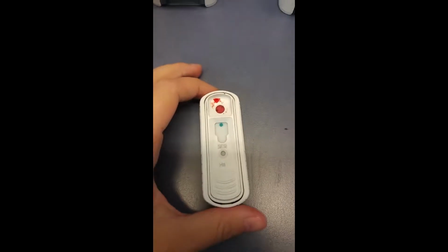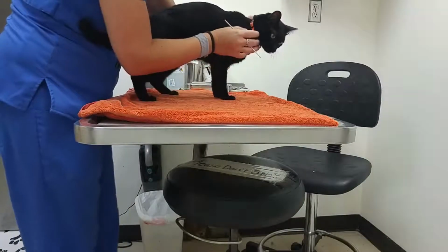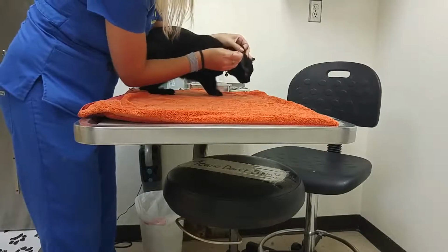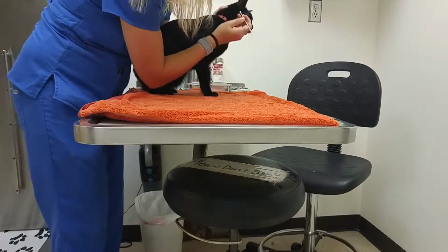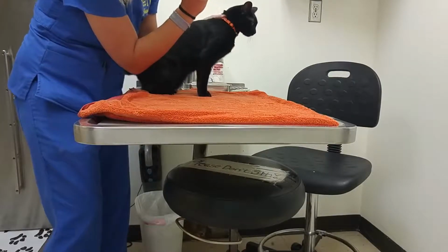So the test is negative. Here's the problem with this kitty. He's scratching his right ear, so we're going to take this Q-tip here. And we're going to just kind of get that in there and get some debris on it. We've got some on there.